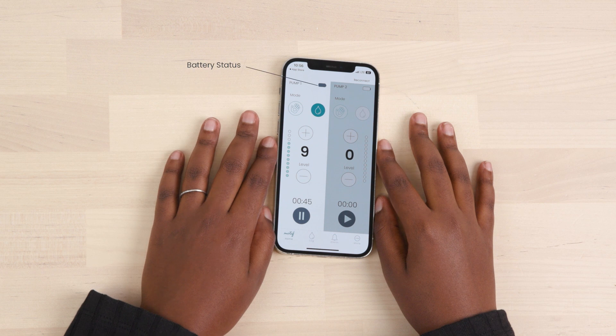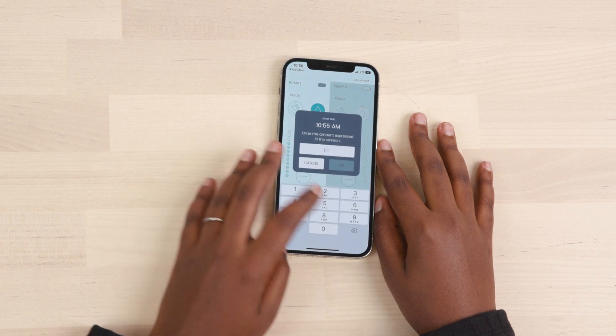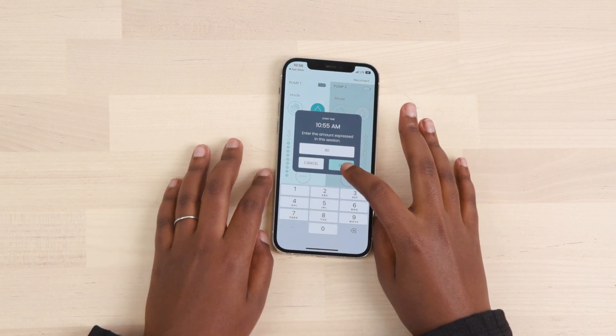When connected, the battery status of the pump is shown at the top. Press the pause button when you're finished pumping. A prompt will appear to log the amount of milk you collected.